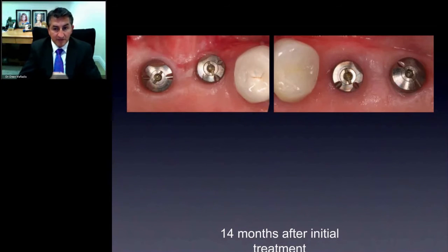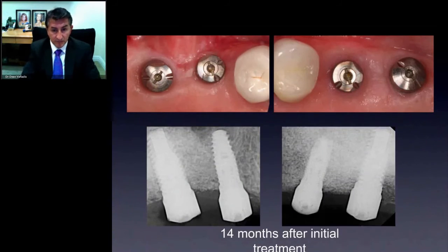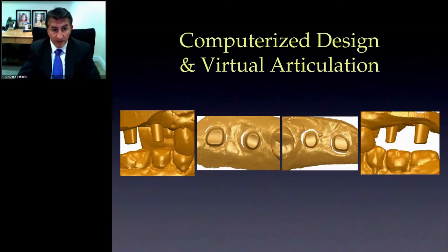Well, think about taking a final impression of this with material or with a scanner. If you have a scanner, it would be a great way to just take a final impression of 4 implants. So for the first restorative treatment, we'll take our impression, we'll look at our CAD CAM abutments, and we'll try to maximize our emergence here, so we're actually reviewing our final abutment instead of just waiting and hoping you get something that works. We're trying to close the space as much as possible here. We're giving the technician a biotype photo and a radiograph photo.